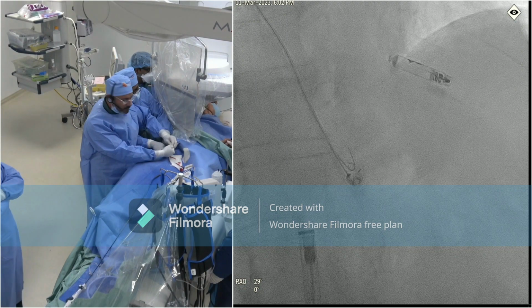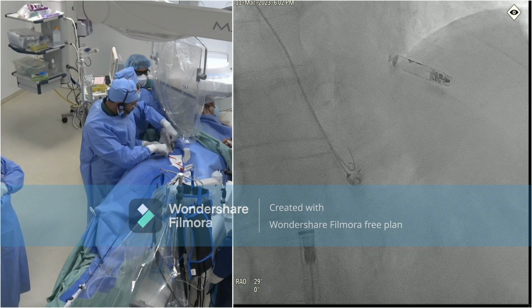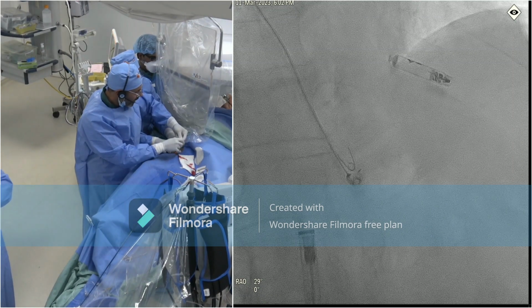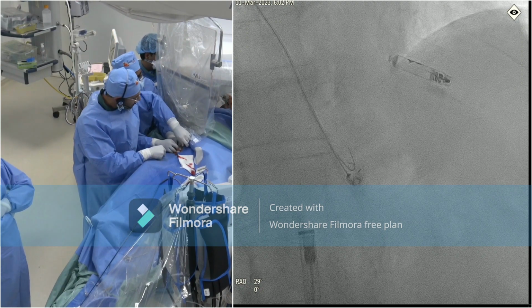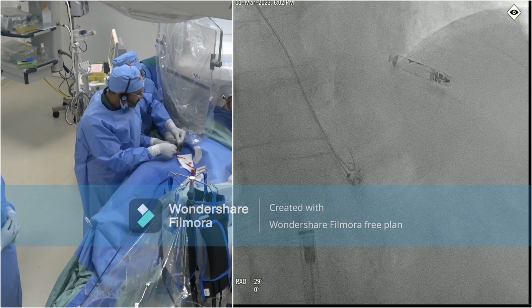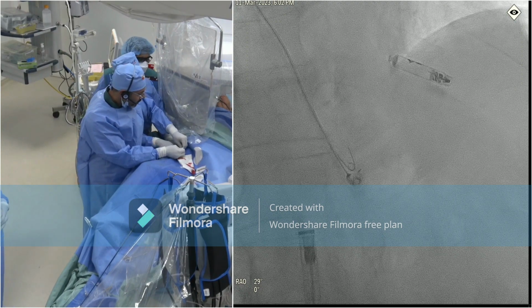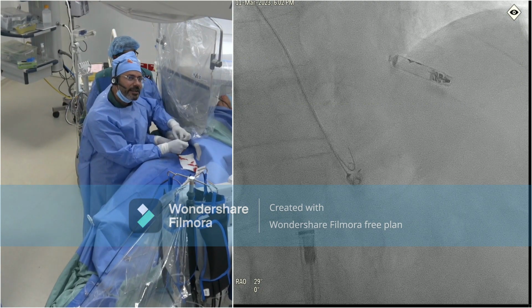Excellent. We do the same, by the way, because the worst thing that can happen is that the patient develops DVT post procedure and you have to give anticoagulation acutely. So we try to avoid that. We try the maximum by giving fluids, hydrating the patient, giving heparin during the procedure, and monitoring the flushing, and that's it. By that, we finish the procedure. And if any questions, we are here. If no questions, I will see you at the faculty dinner, hopefully, because I'm hungry, to be honest.